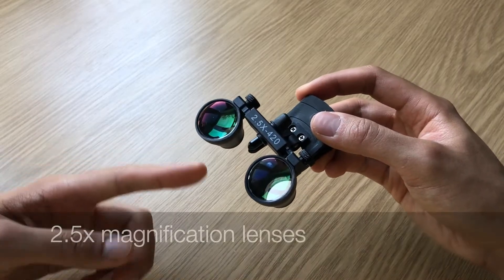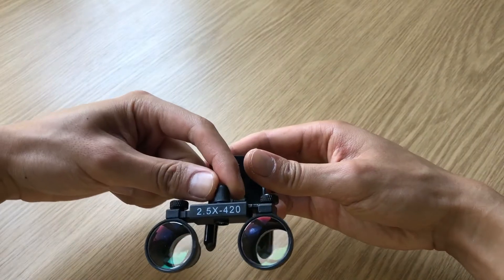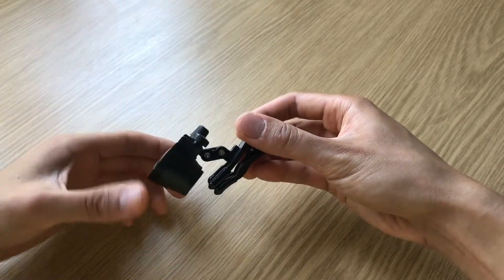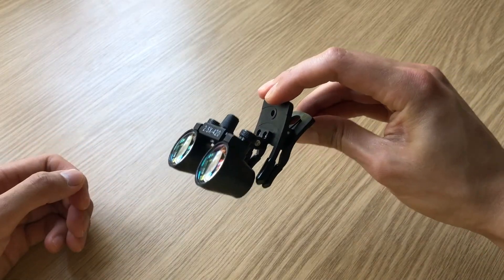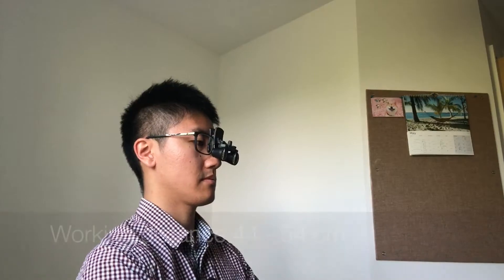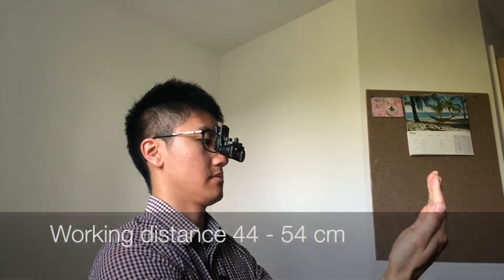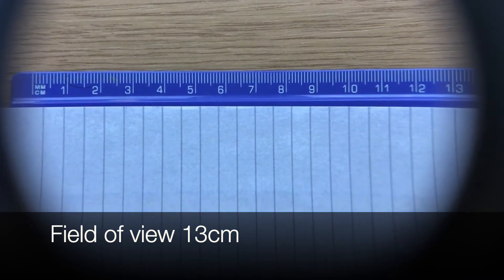The loops are essentially two magnifying lenses of 2.5 times magnification, mounted on a frame where you can adjust the interpupillary distance. That's mounted on some hinges, which are then attached to the clip that clips onto the glasses. The loops have a working distance of 44–54cm, which is about how far away you would hold a book. The field of view at this distance is 13cm, which is about how much you would see through the lens.